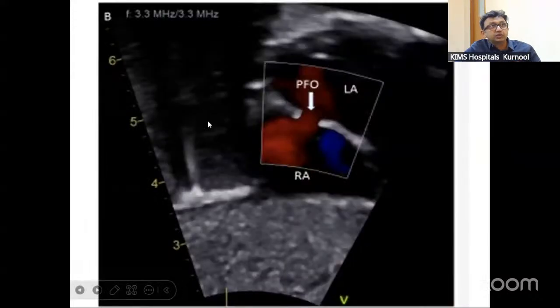You can also, in this same view, assess your blood flow. This is where your SVC will be. The blood flowing from the SVC will appear red in color. If you want to measure SVC flows, this is also the view from where you can measure.